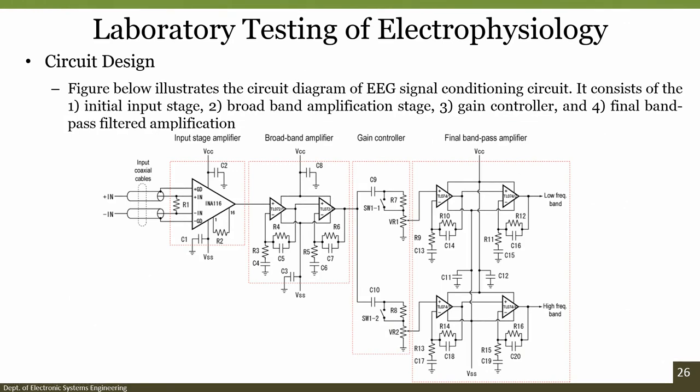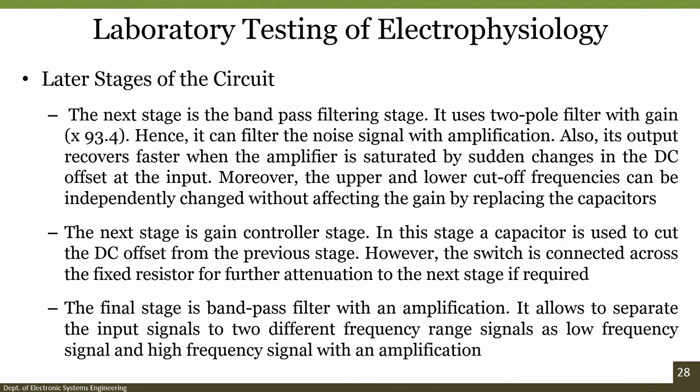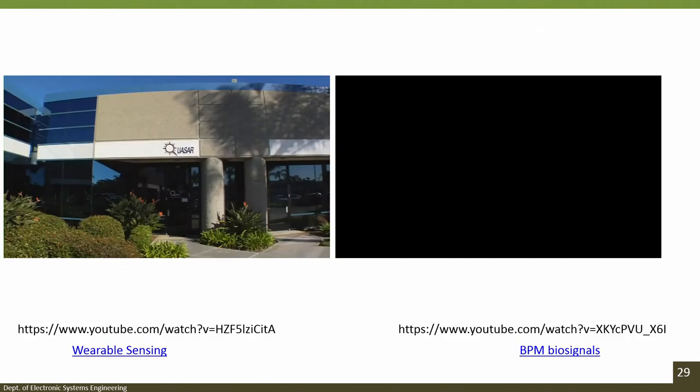So, I leave it to you with two videos, and then you will understand more about what dry electrodes are and how the signals in EEG using dry electrodes can be captured. Alright. So, let me just play the first video.